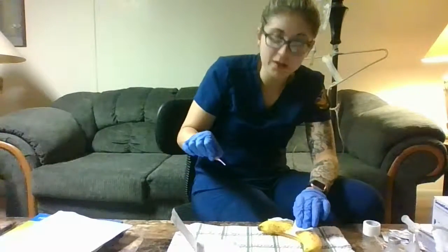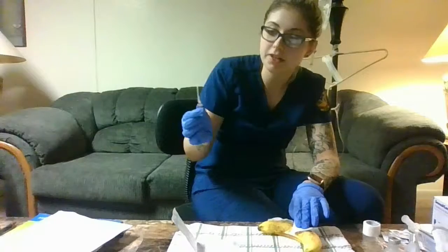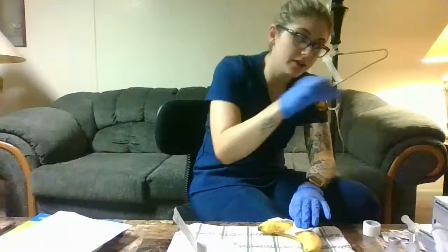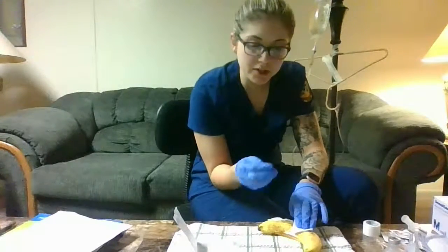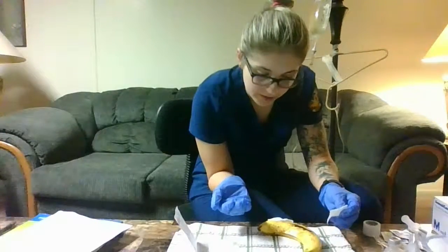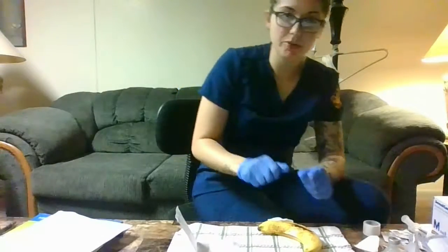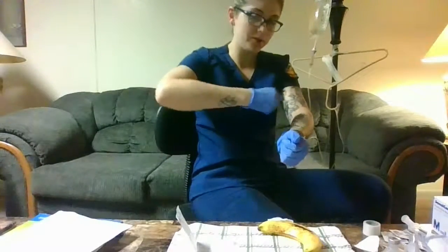Okay, so we're going to apply pressure for 2 to 3 minutes. We're going to check this for the intactness of it, make sure that a piece of it didn't chip off or break off. And then after we've done that, I'm going to put it in the sharps container. If they're on blood thinners, like Coumadin, we're going to have to hold pressure for a little bit longer. You know, assess the site. Make sure there's no redness, tenderness, swelling right there. And we can put on a sterile dressing or another gauze pad with some Coban over it.